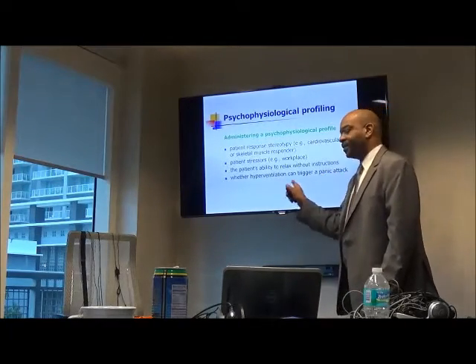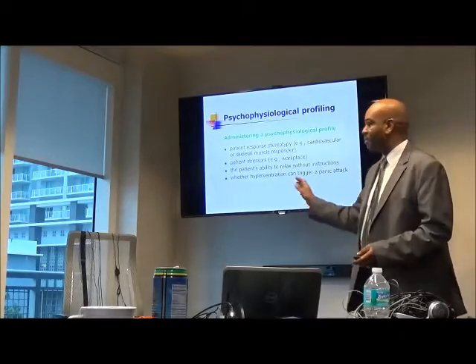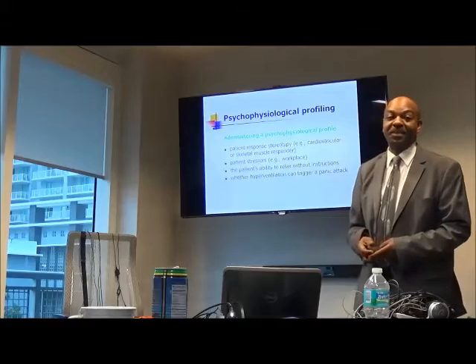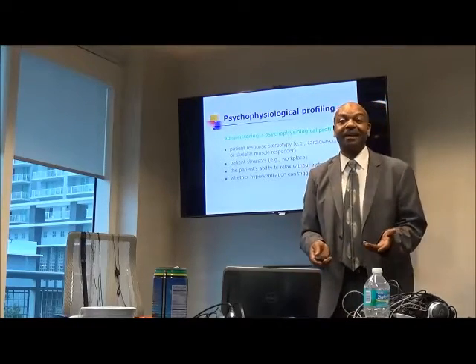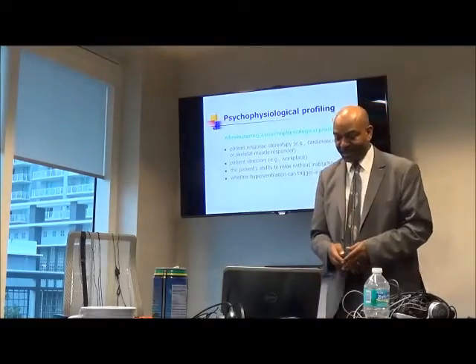And then the last one, for any people who decide that they want to make people hyperventilate, then you would see whether, when they hyperventilate, it triggers a panic attack. I wouldn't bet against it, so that's why I don't bother doing it at all myself.